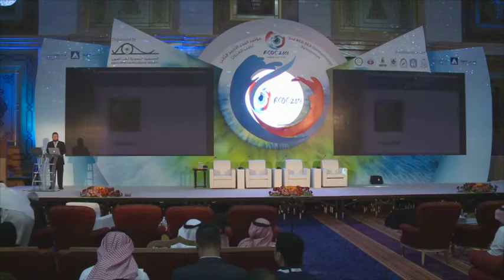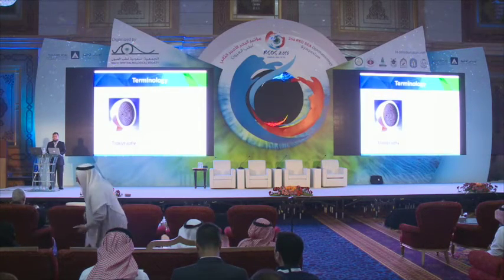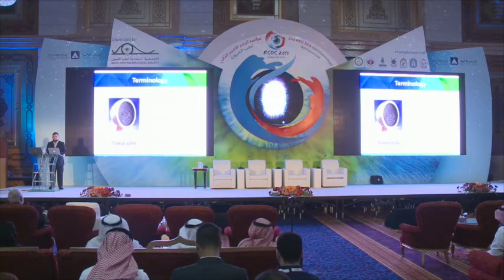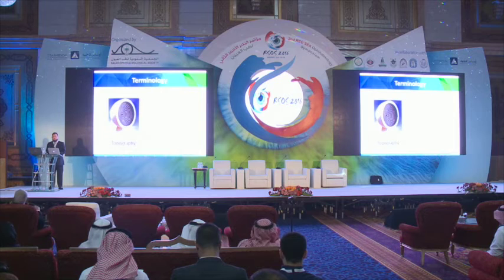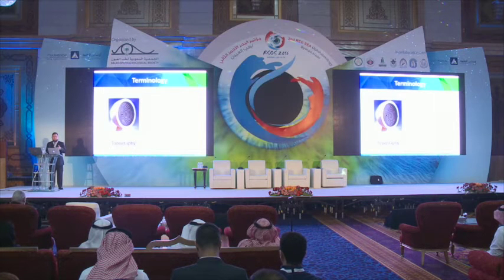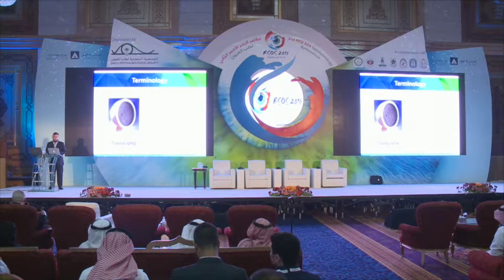What is the difference between topography and tomography? You may find these two terms in journals and also in conferences. Actually, the first name for the instruments taking details of the cornea were topographers.